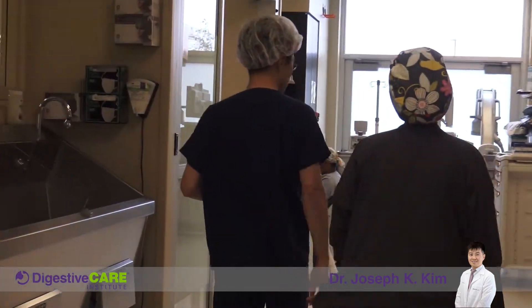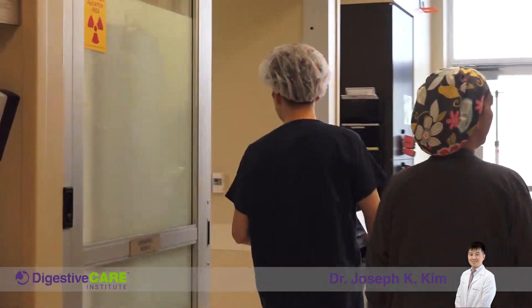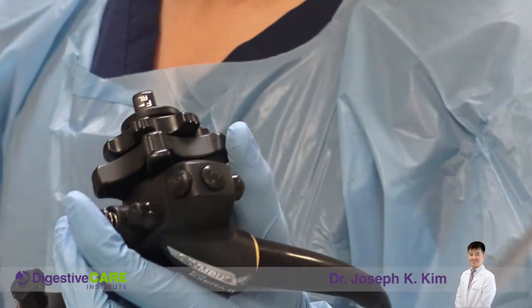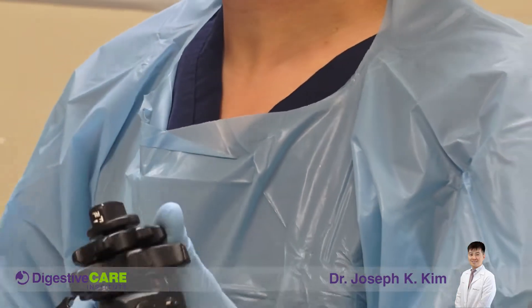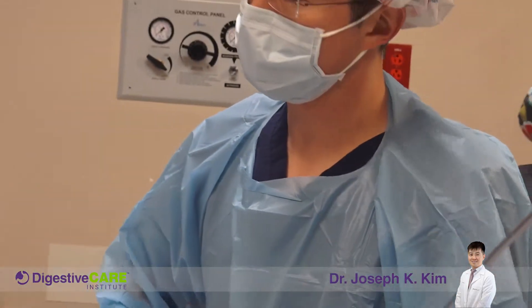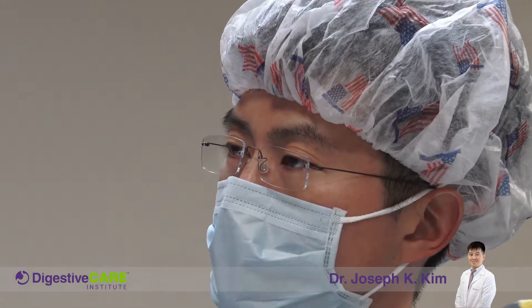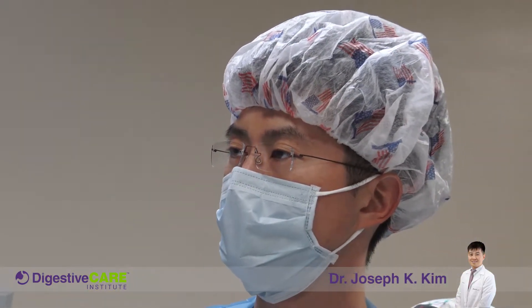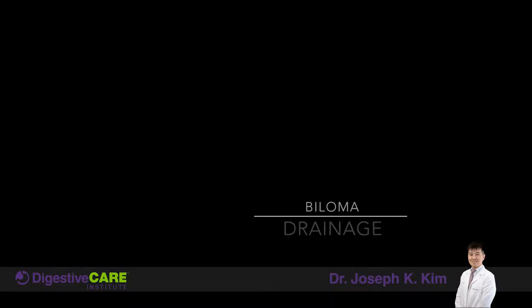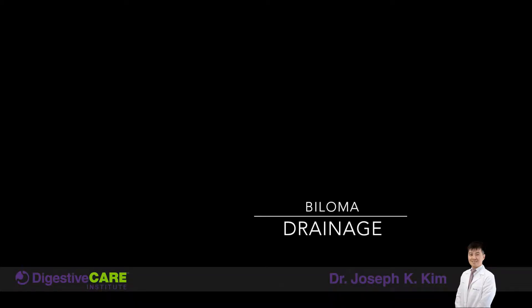The goal of this procedure was to perform endoscopic ultrasound guided access into this biloma, followed by placement of a wire into it, followed by placement of two stents going from the stomach into the biloma to drain it internally. This is all endoscopic without the need for any surgery.